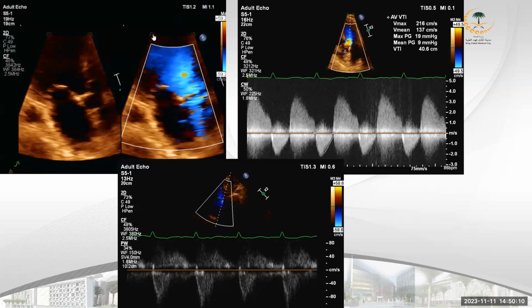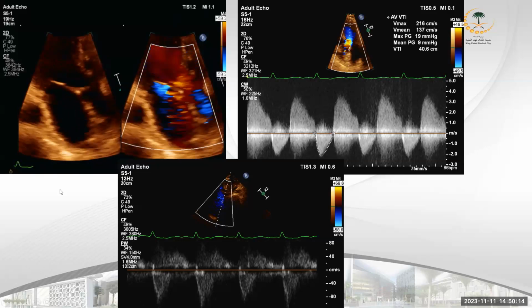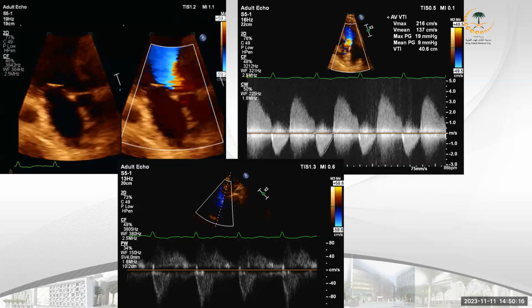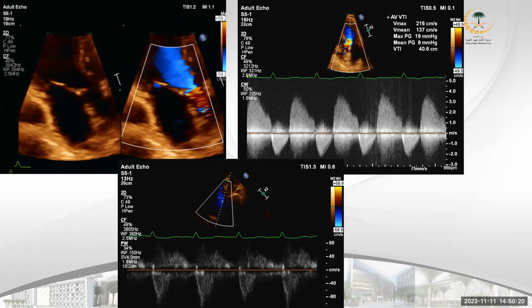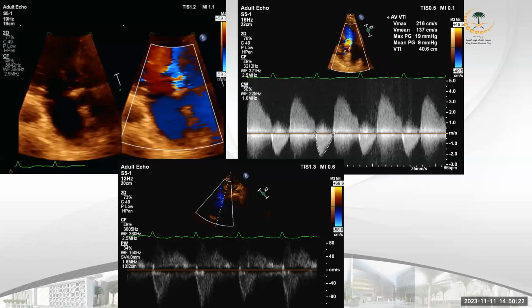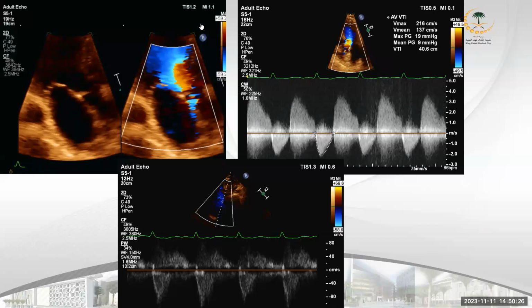Severe aortic regurg. Okay, again, it's severe, but why? Believe me, in the exam, if you call severe aortic regurg without the etiology, that means your answer is not adequate. Yes, it's the diastolic flow, but why? That means, what's the etiology? Why do you have severe AI?